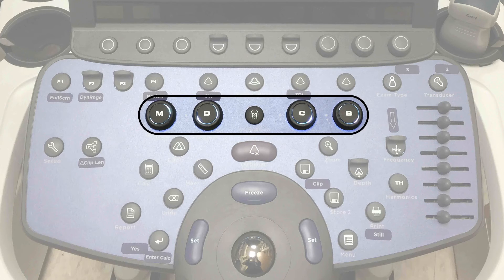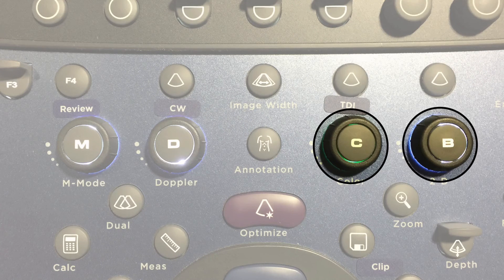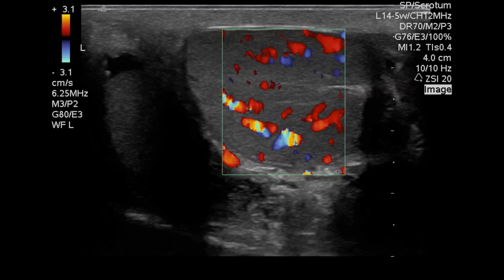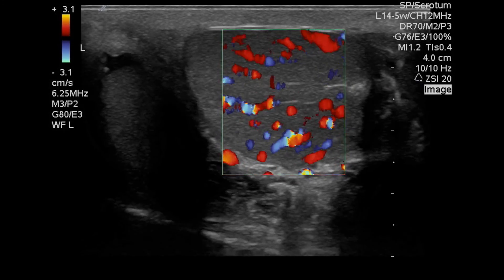The dial will adjust the gain of that mode — such as adjusting color gain, M mode tracing gain, or overall B mode gain. Whatever mode is currently active will be highlighted in green. Here we have activated color mode, and you can see the color box on this blood vessel. Color Doppler imaging displays the standard pattern of blue away from the probe and red towards the probe.